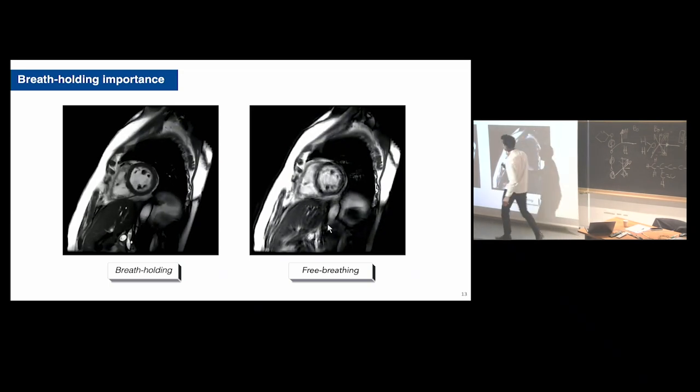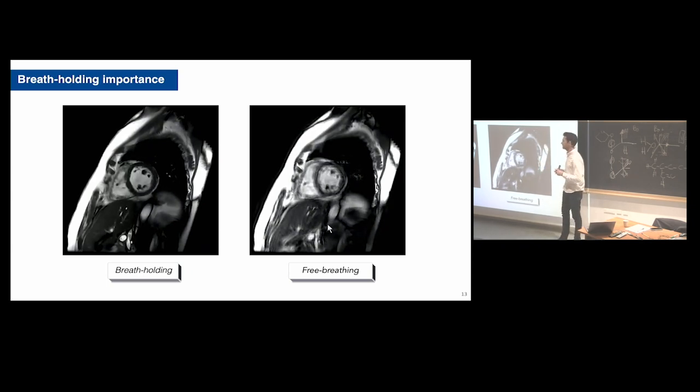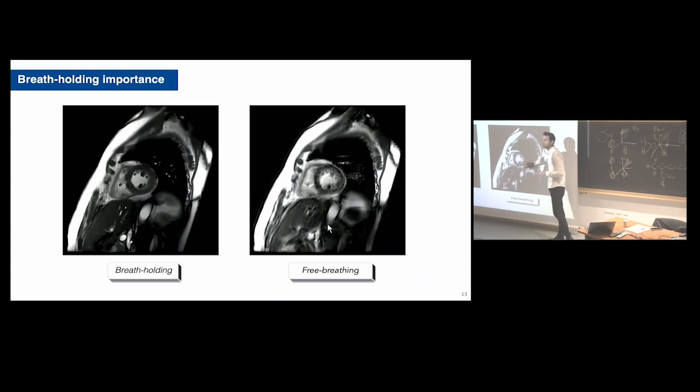You see the great contrast between the myocardium and the blood, and this is a fast acquisition. You see a problem here. This is another challenge with cardiac MRI. We ask a lot of breath holds of our patients. Most of the acquisitions are performed under breath holding. If the patient does not manage his or her breath hold, this is what we get.